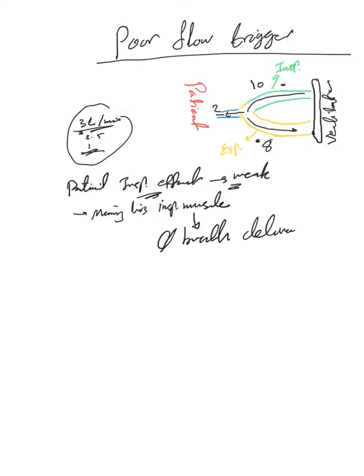delivered by the ventilator. So you can tell that the patient, this is a poor trigger. So this is the first scenario, and simply you can solve it by lowering this threshold from 3, for example, to 2. Then that will solve the problem.